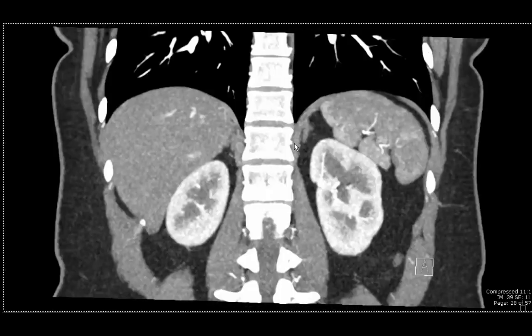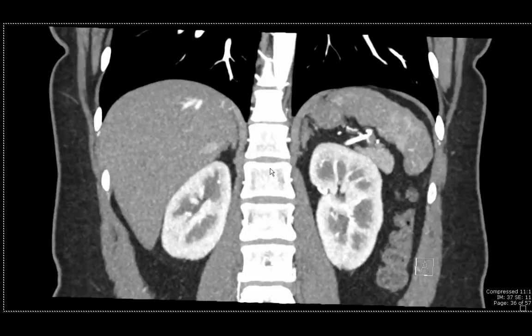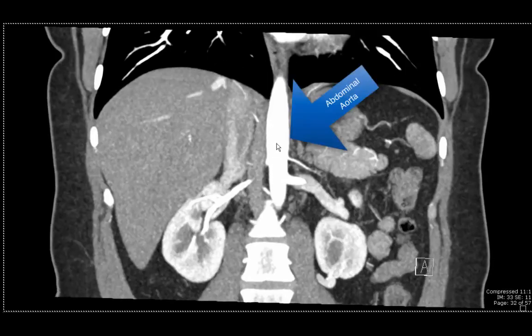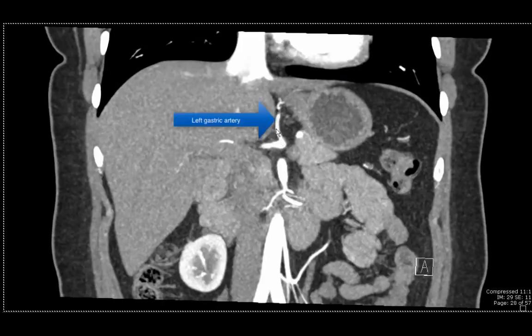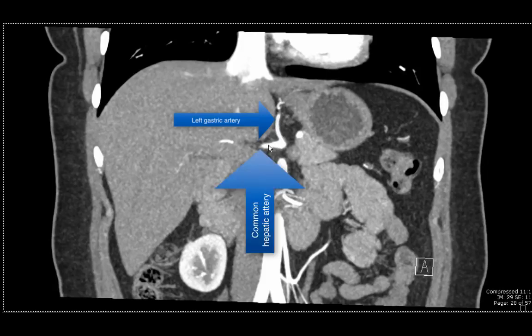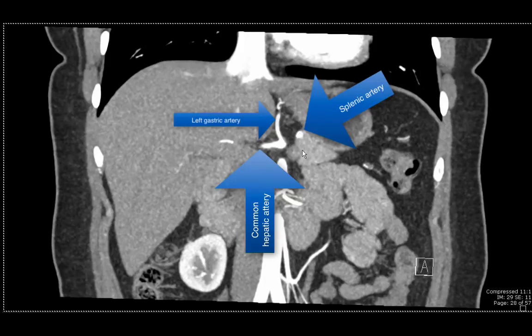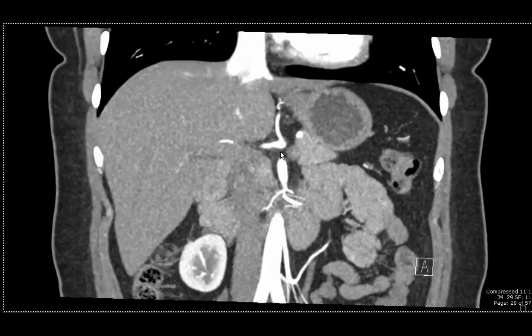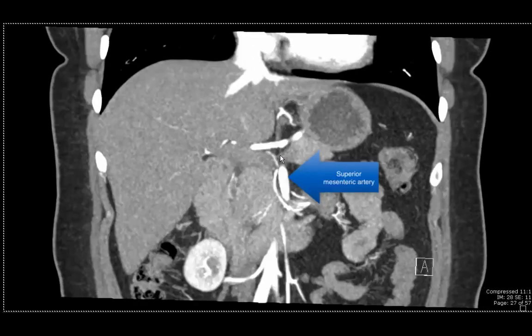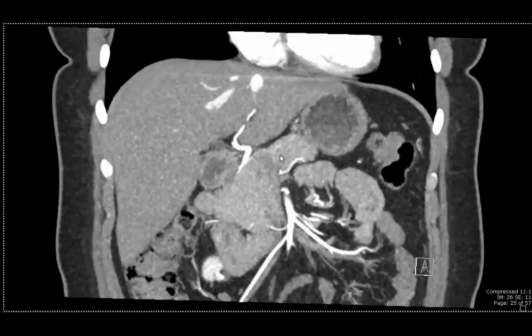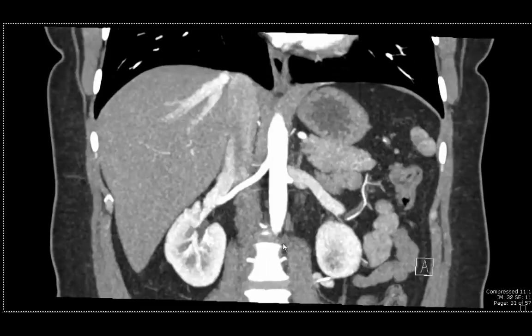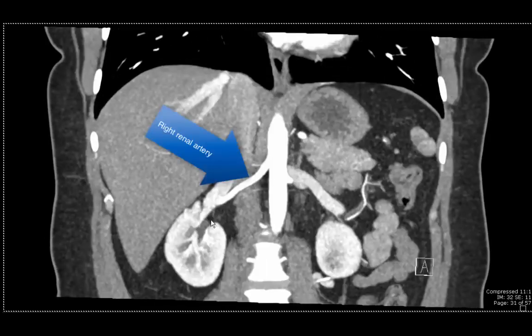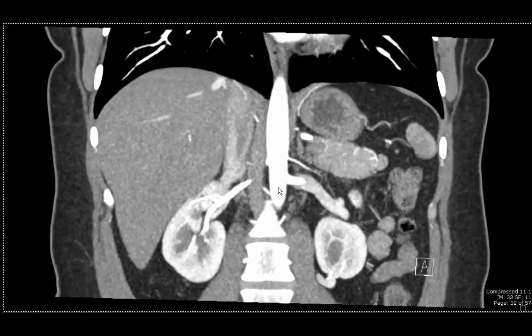To review some of the arterial anatomy in the coronal plane, we go back to the arterial phase images. As you scroll from posterior to anterior — the spine indicates posterior — you can start to see the abdominal aorta. The first branch is the celiac artery, which gives rise to the left gastric artery going cephalad, the common hepatic artery going to the right, and the splenic artery going to the spleen. The next big branch is the superior mesenteric artery, supplying the small bowel and majority of the large bowel. The last branch is the inferior mesenteric artery. On this image we can also see the right renal artery going to the kidney, and the left renal artery arising slightly more inferior going to the left kidney.